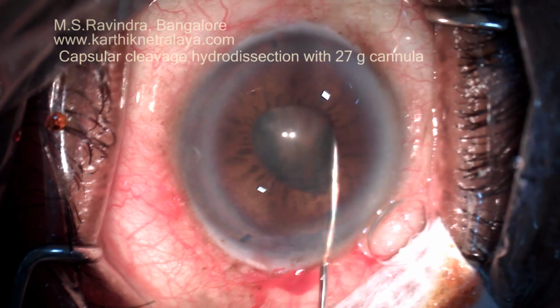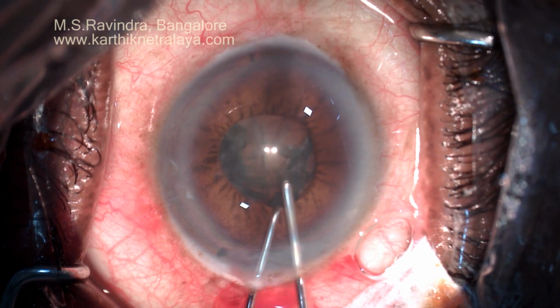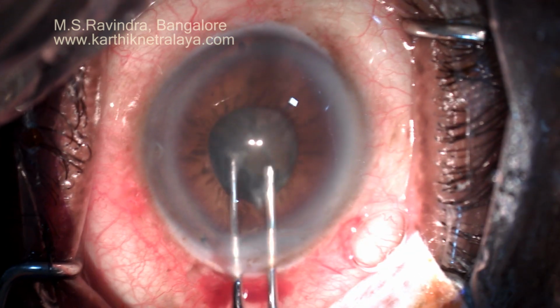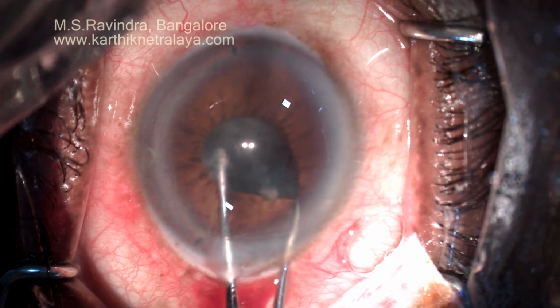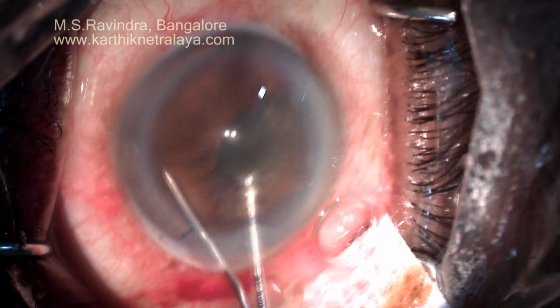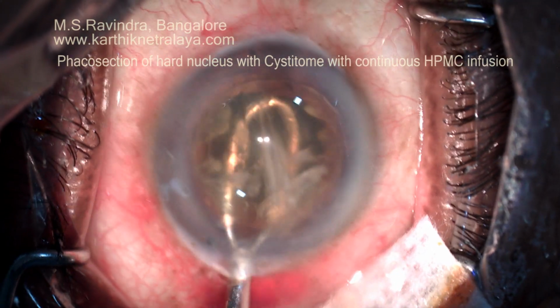The tip of the modified cannula is ensured to be kept inside the capsular bag. Nucleus is bimanually rotated using a 25 gauge cannula and a hook, Sinski hook. The nucleus is rotated into the anterior chamber bimanually. The visco is continuously being injected in front of the nucleus so that it is kept separated from the endothelium.